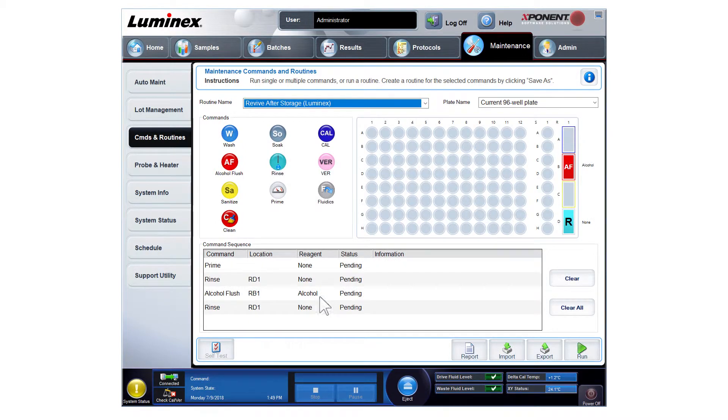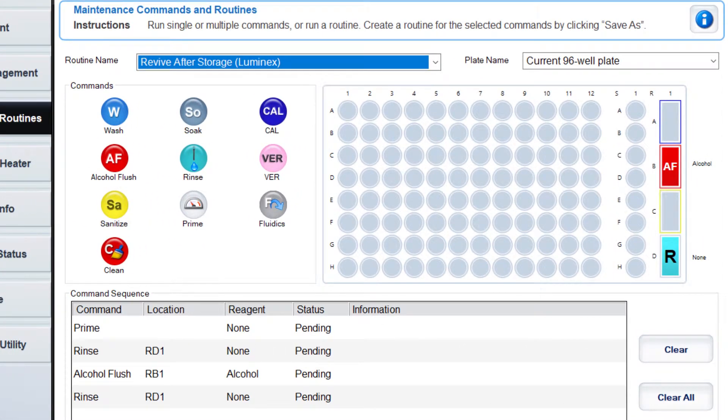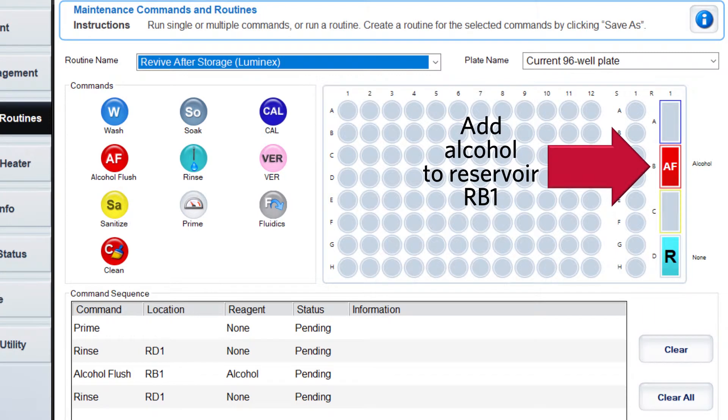As indicated in the diagram on the right of the page, 70% isopropanol or ethanol should be added to reservoir RB1 on the off-plate reagent block.